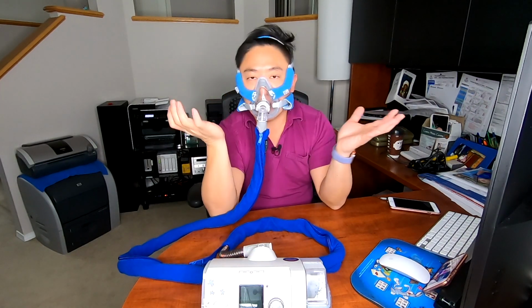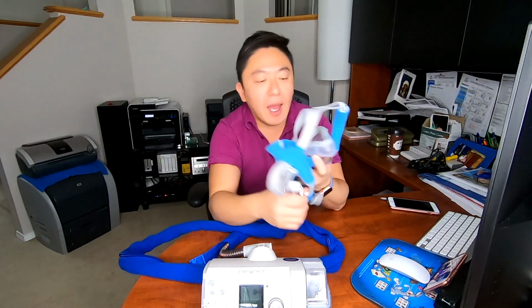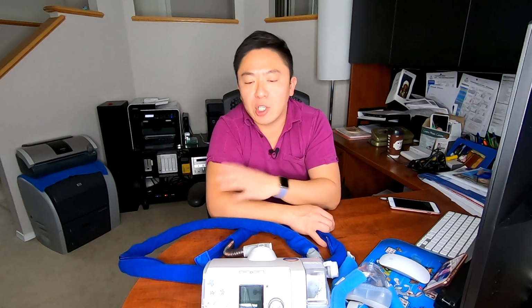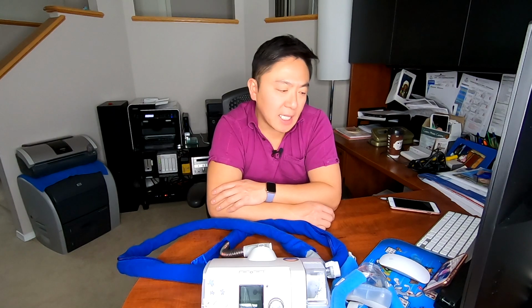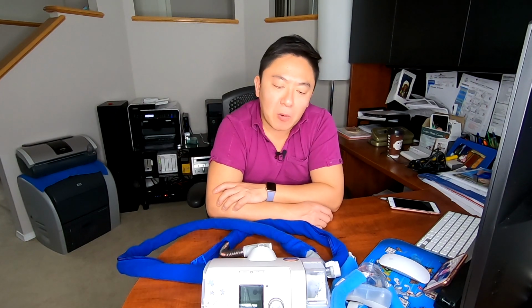And then you just basically lay down and you breathe normally, and then you eventually fall asleep, and then the machine basically takes over in managing and controlling your apnea and hypopnea events throughout the night. And so that's pretty much what CPAP therapy is about.